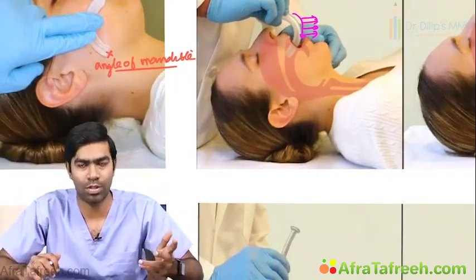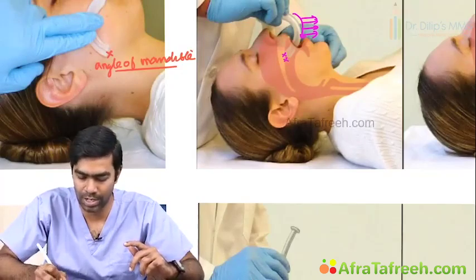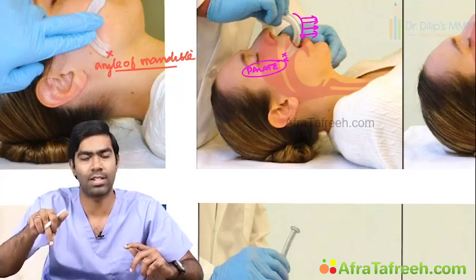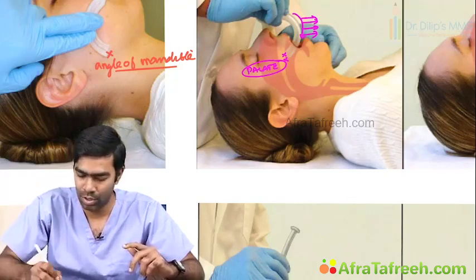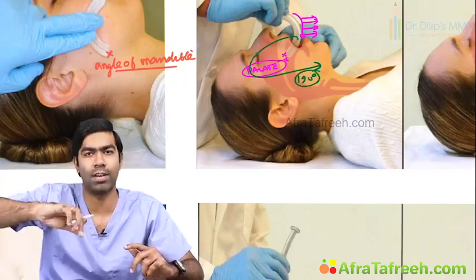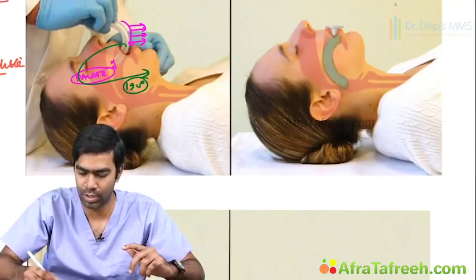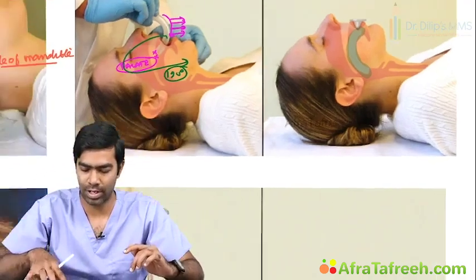So it's actually opposite to the oropharyngeal curve, but let me tell you why. At one point it goes and starts hitting the palate here. Definitely it will start hitting the palate. The palate will not allow any more movement. So when you feel resistance at that point, which means you are hitting the palate, then rotate the airway 180 degrees so that it nicely and smoothly fits into the curve of the oropharynx. So this is how you place the oropharyngeal airway. Clear?